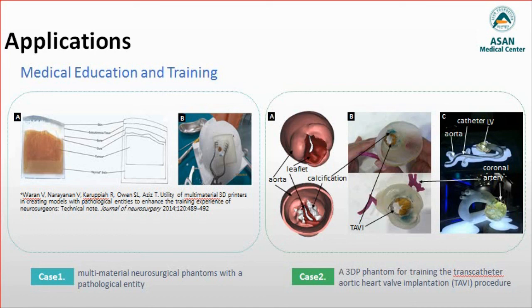In addition, a 3DP phantom with multi-material could provide trainees or surgeons with various educational and rehearsal simulators based on both patient-specific and disease-specific anatomy. By training and rehearsing with these simulating phantoms, trainees and surgeons may gain more confidence before performing real operations.